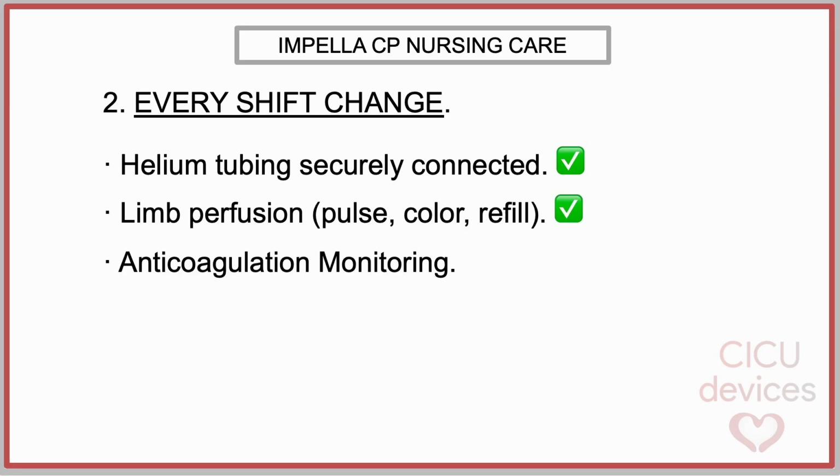Confirm the current anticoagulation regimen prescribed by the physician. Document the anticoagulant agent, dosing schedule, and therapeutic targets as ordered, as well as the timing and dose of the last anticoagulant administration. And verify the most recent anticoagulation laboratory results and the timing of the next scheduled test.